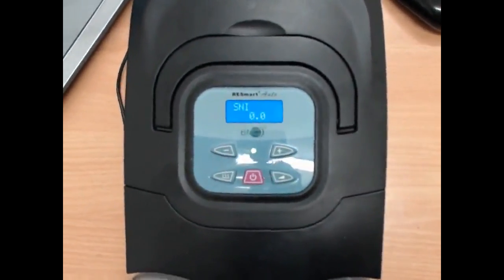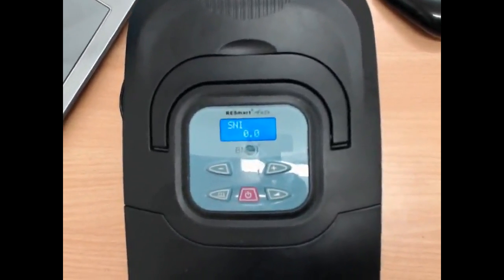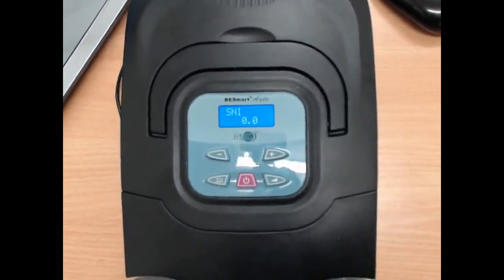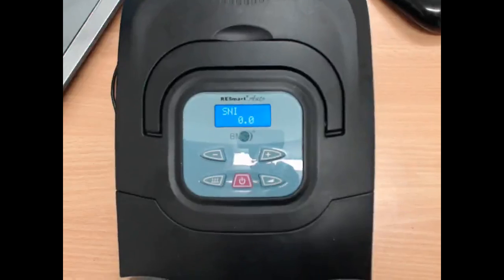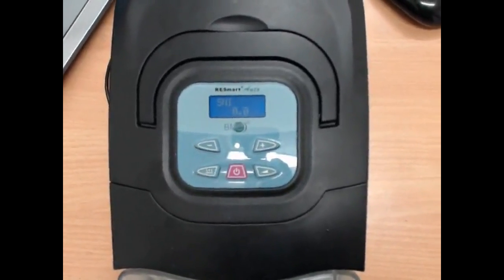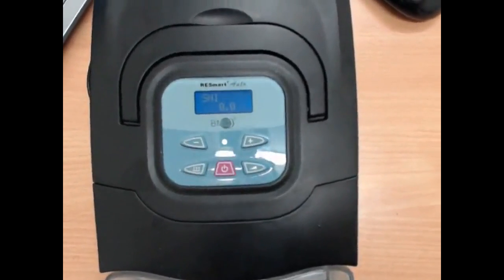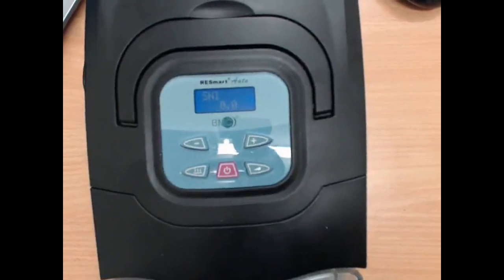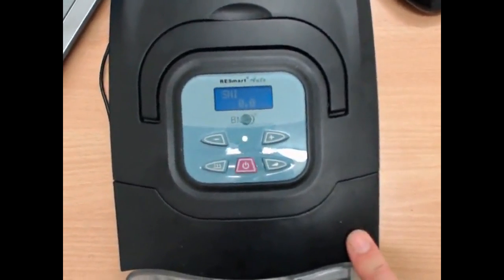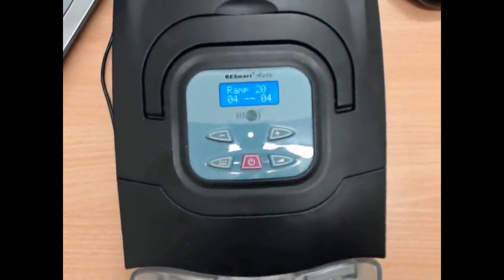You might try increasing the minimum APAP pressure to bring that up, or perhaps you've capped the upper limit too low and you need to increase that a bit, because there are some times when the machine's reaching a ceiling of pressure and it can't go any higher because you've capped it too low. So these are all the sort of things you can do with this. You might want to try changing it from automatic therapy to fixed pressure to see if that has a benefit as well. Now, I'll just press this button which takes us back to the main screen.